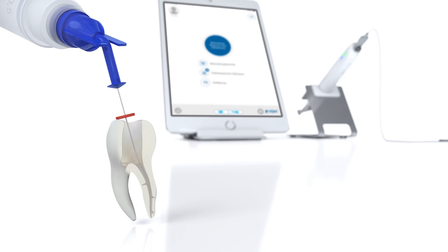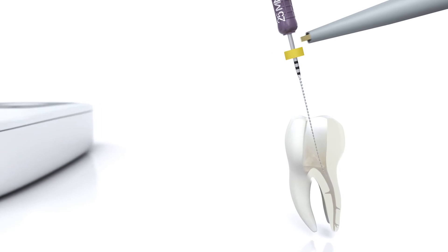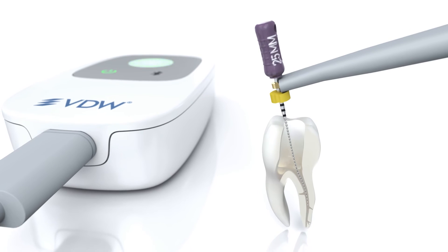Irrigate the canal and reconfirm canal patency, for example with an ISO 10 C pilot file. Determine the final working length using an electronic apex locator.